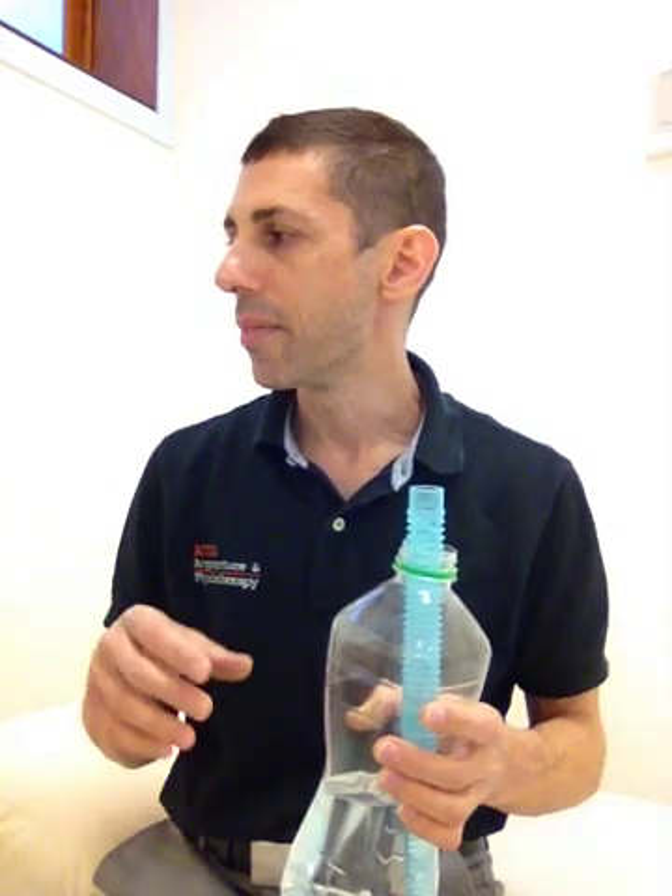So give that some thought. If it's good for you or your clients, wonderful — set them up with the bubble PEP, or look at the acapella scenario, or the PEP pipe that we had a look at last time around. All the best. This is Nathan at ACUS Acupuncture and Physiotherapy. Check us out at acus.com.au. Bye.